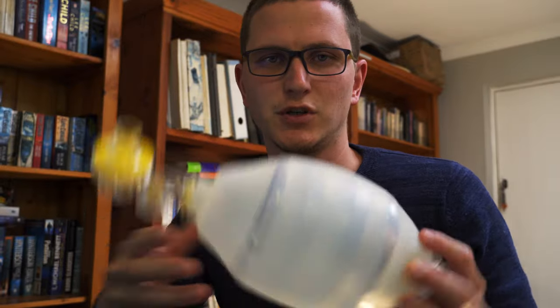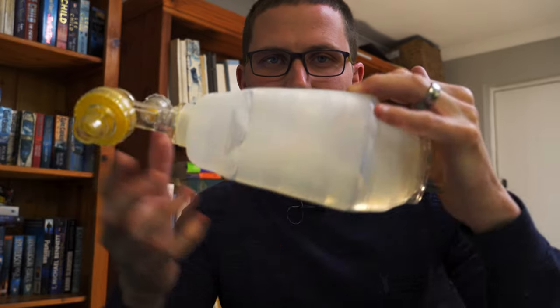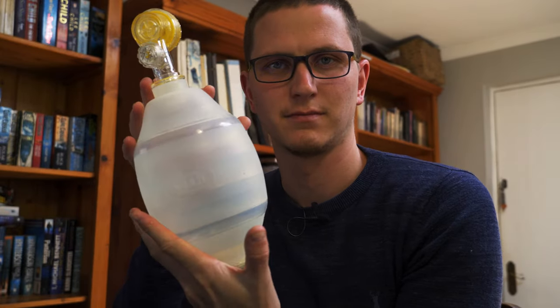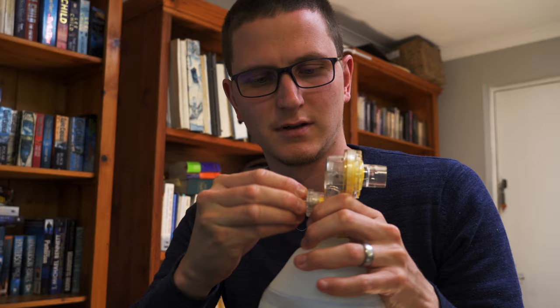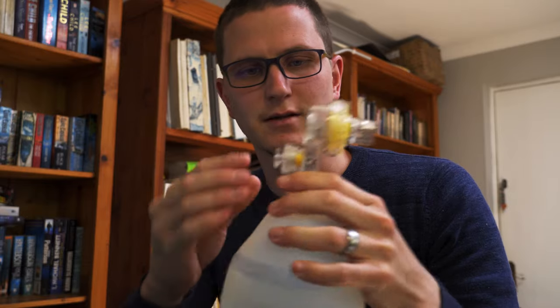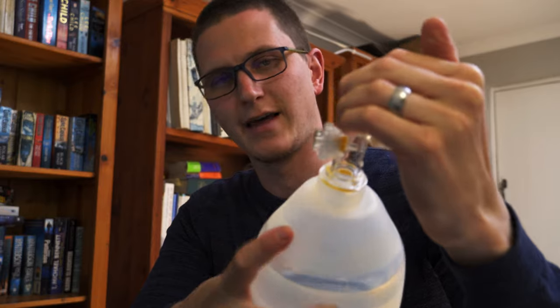Question one: does it open when you squeeze the bag? Question two: if I squeeze the bag and empty it, does it stay deflated? As you can see, it does. If I let go, it re-inflates — that's a sign the valves are working correctly. The other thing is to close the pop-up valve. If I squeeze with it open, air comes out; if I squeeze with it closed, no air comes out of the bag. That's the quick three-second check to see if the bag is actually functioning properly.